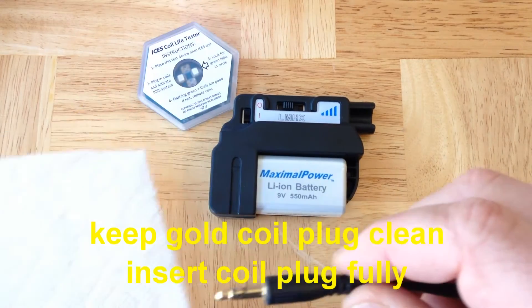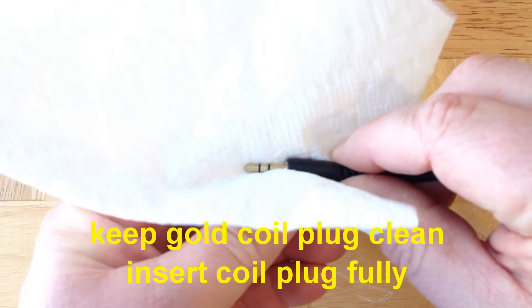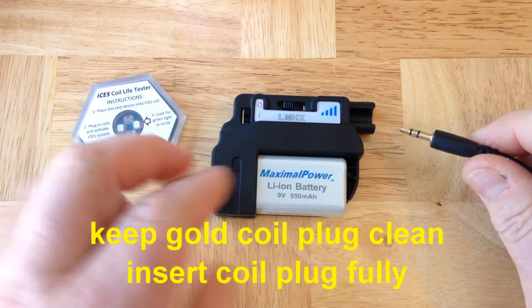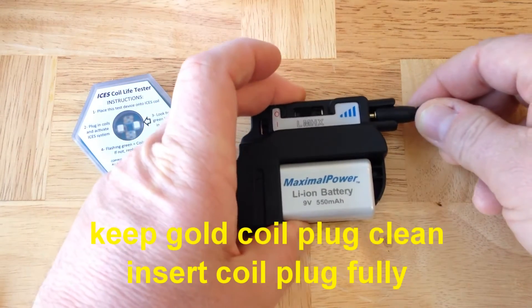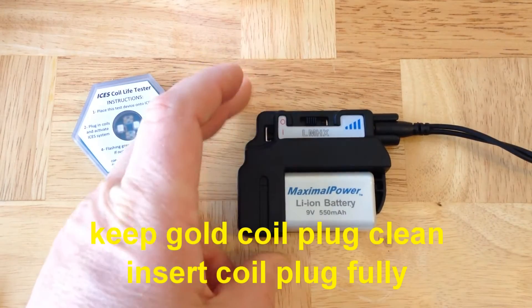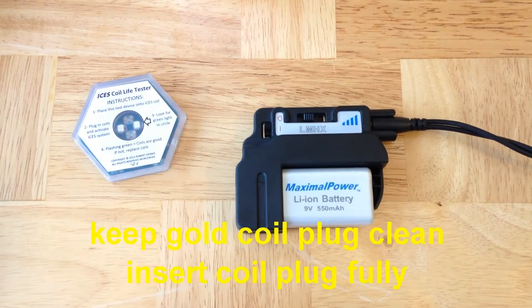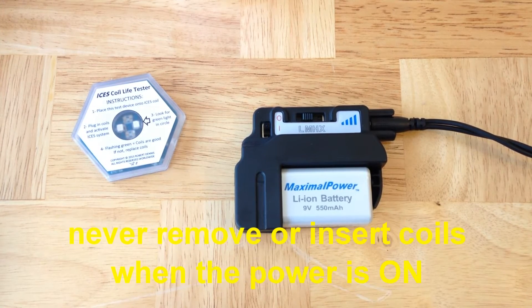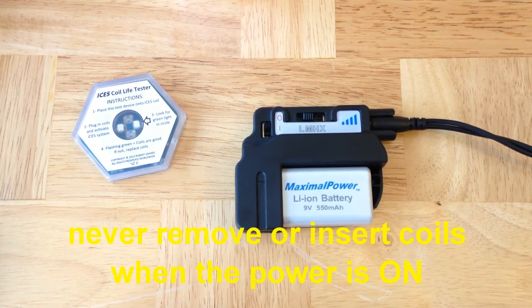Whenever you remove the coils, clean the plug with a clean cloth or paper towel. Then insert the coil all the way, every time. It's best to do this when the power is off to avoid any chance of short circuiting the output. Never remove or insert coils with the pulse generator running.